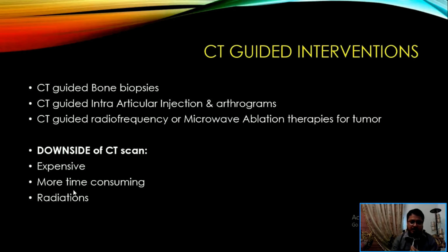So in our department, we offer these procedures very frequently under CT guidance or even ultrasound guidance, and there are some limitations of CT guidance as well as ultrasound guided procedures. We do bone biopsies, intra-articular injections and arthrograms, and CT guided radiofrequency or microwave ablation therapies in our department. I have been doing ablation therapy of bone since 2014.